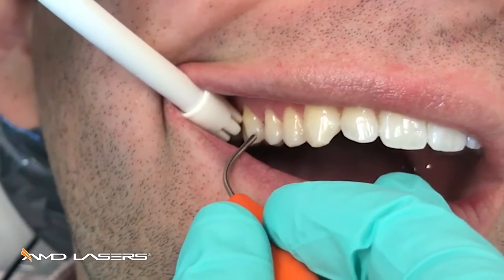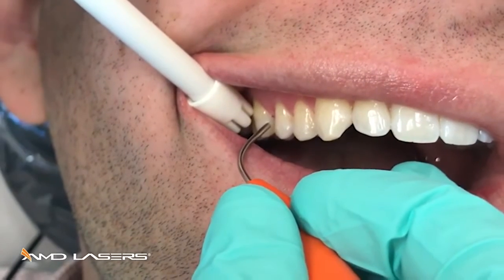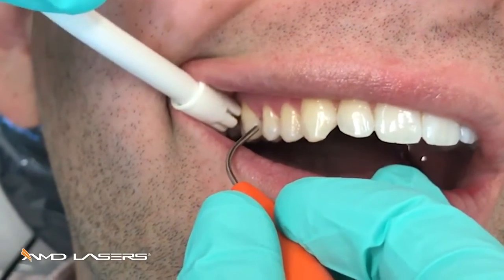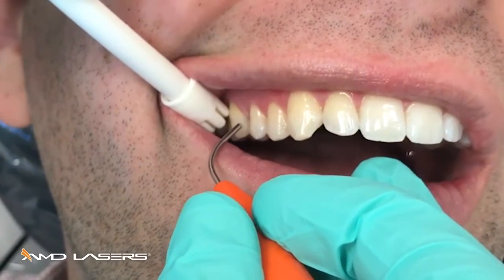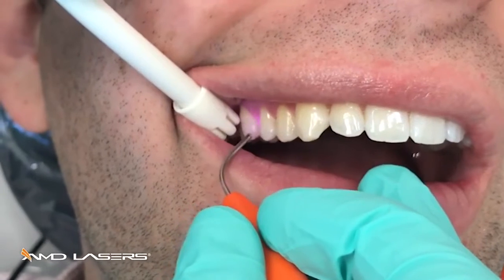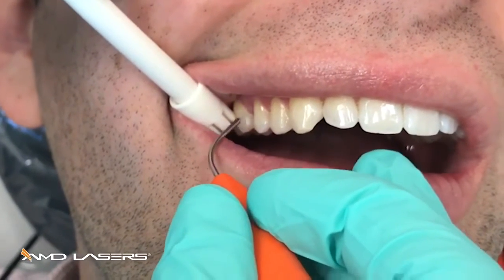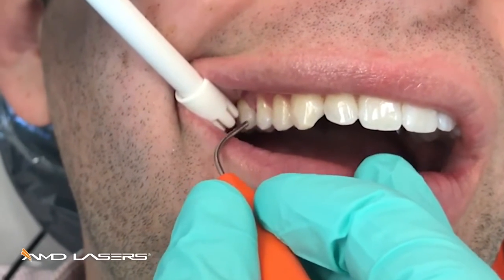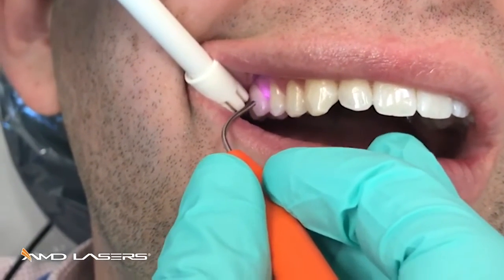What I want to do is go to the depth of the pocket, find the deepest area of inflammation, then back up about a millimeter, start my movement gently against the tissue, and then fire for a few seconds, gently rubbing against the pocket wall.